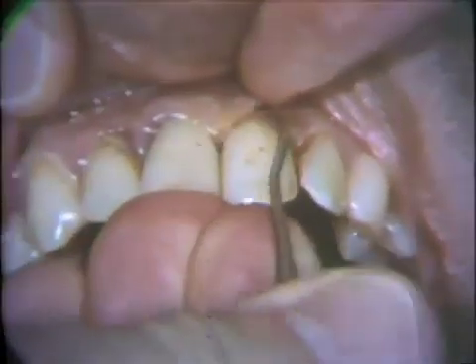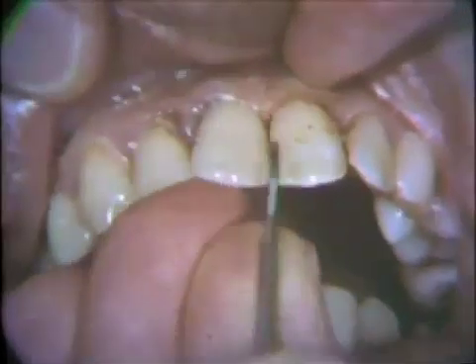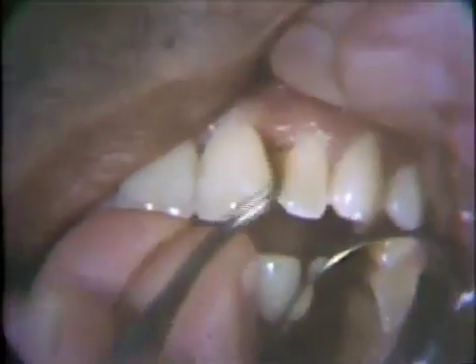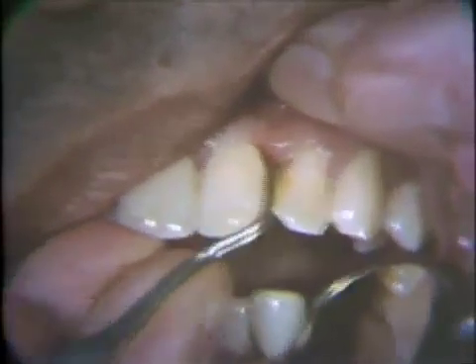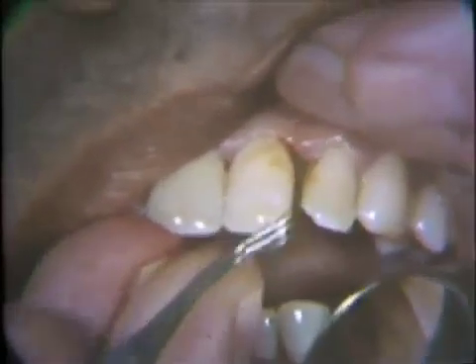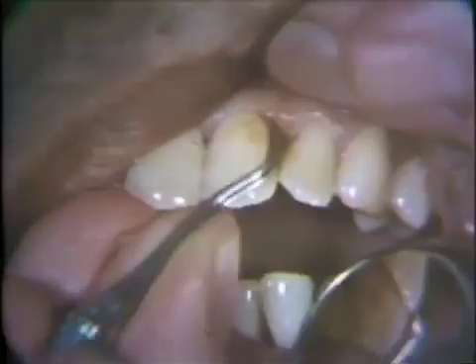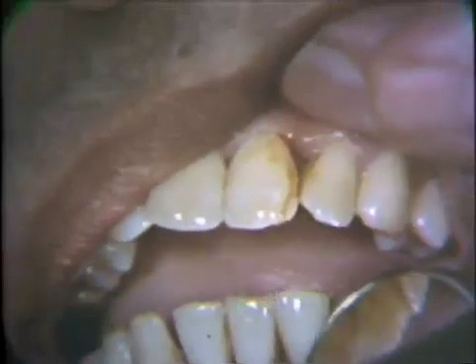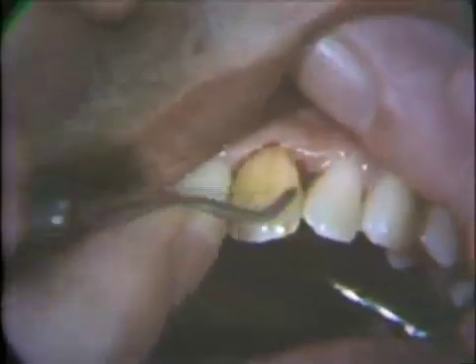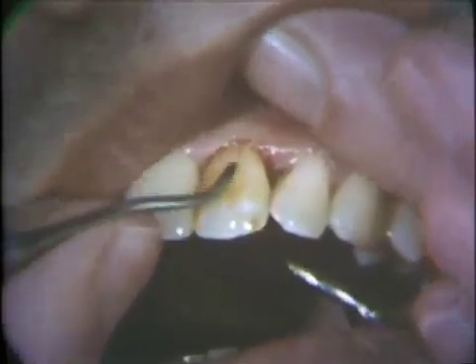Care must be observed to avoid forcing calculus into the supporting tissues. The cementoenamel junction and root surfaces are smoothed with a periodontal file, first on the distal side and then on the labial side. Even if no discrete particles of calculus are present, it is desirable to freshen the root surface by planing. Obviously, a thorough familiarity with the contour of the gingival attachment is essential before commencing the scaling and planing procedures.